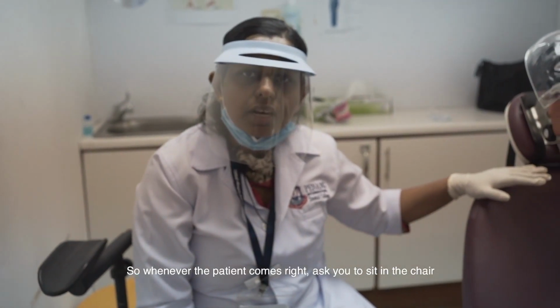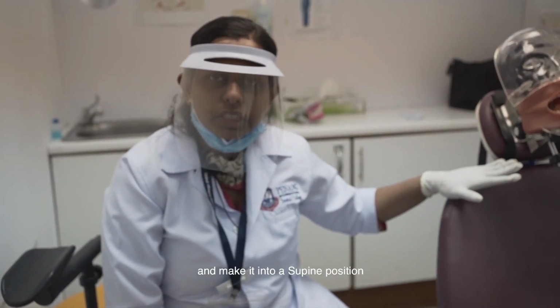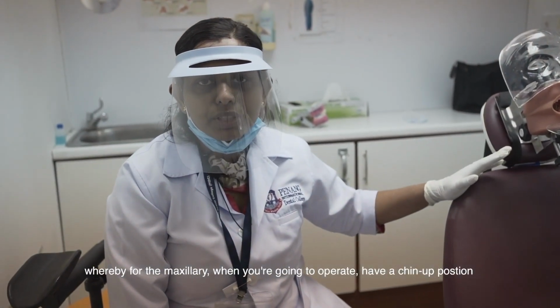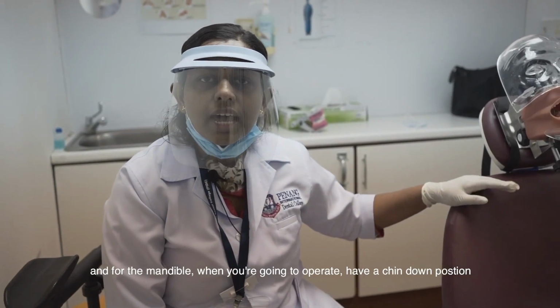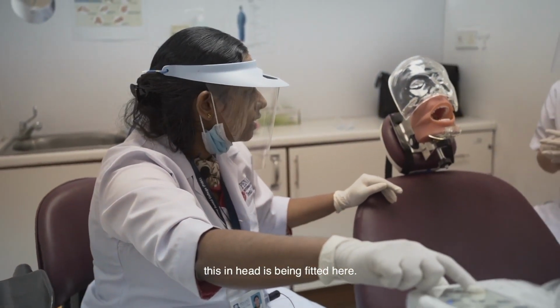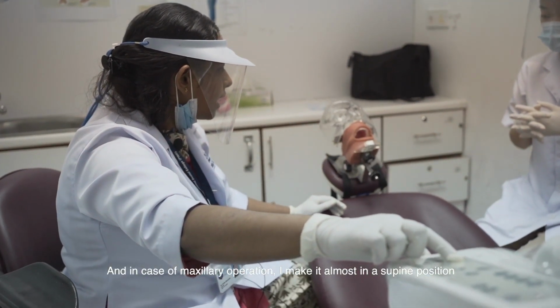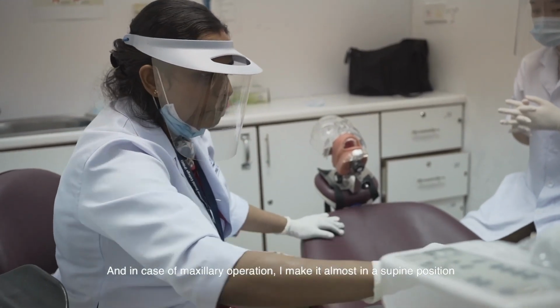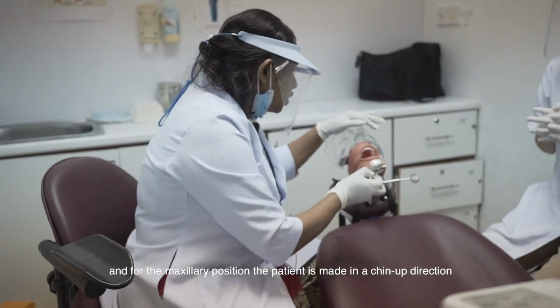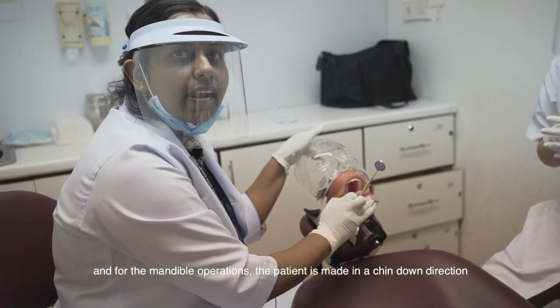Whenever the patient comes, ask him to sit in the chair and make it into a supine position, whereby for the maxillary, when you are going to operate, have a chin up position, and for the mandible, have a chin down position. You can see that in this case, the head rest is being fitted here, and for the maxillary operation, I make it almost in a supine position with the patient in a chin up direction, and for the mandible operation, the patient is made in a chin down direction.